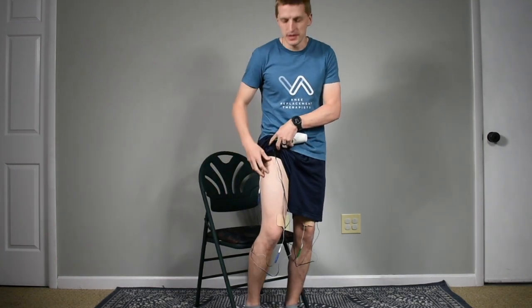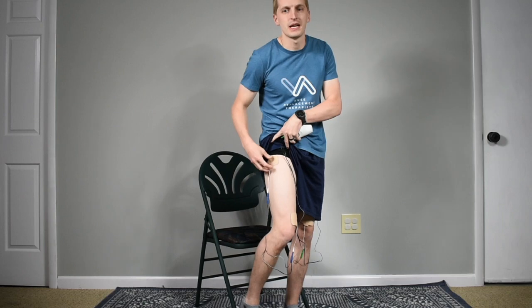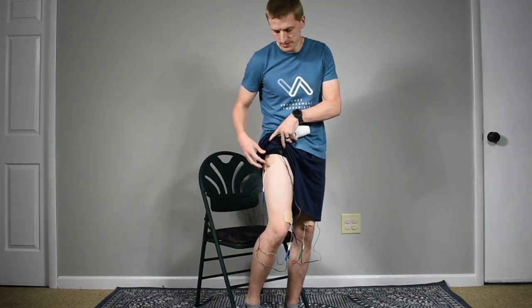The setup involves a small handheld portable unit attached to two different channels, so you'll have the electrical stimulation on both legs. You'll have it on your right leg for your quadricep muscles — both proximally and distally — and also on your left leg. The reason for that is to create alternating contractions that stimulate and encourage muscle re-education for walking and movement.